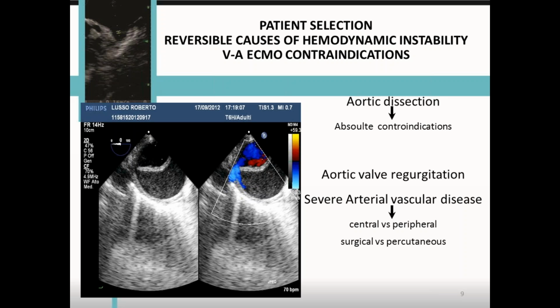You see three things, whether you see it in the mid-esophageal long axis view, or you see it in the form of an RA by seeing the bicaval view, the SVC as well as the IVC with the TR. That is the second view, which is important. The third view is for the fluid status, the transgastric mid-papillary short axis view. And the fourth view, which is also very important to tell you about the right side, is the lower esophageal hepatic vein view, which tells you about the IVC diameter, your RA pressures from the IVC diameter, and how your IVC and your hepatic vein are opening and how it is coming on into the RA. So these are some of the views.